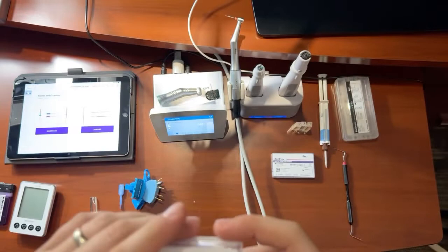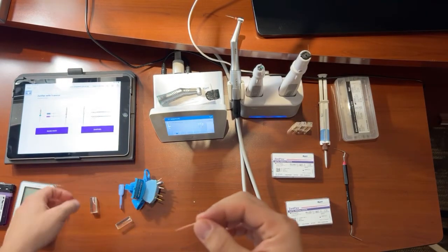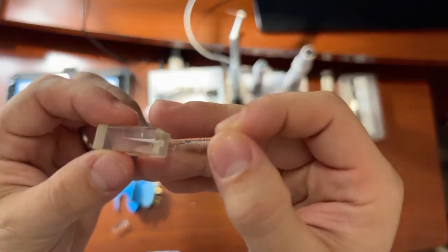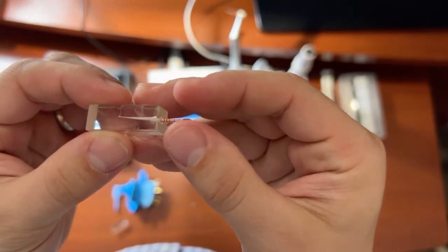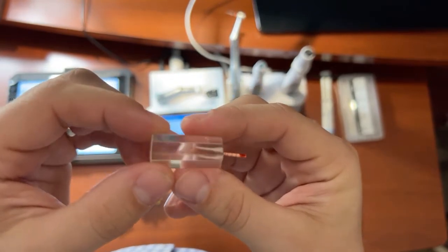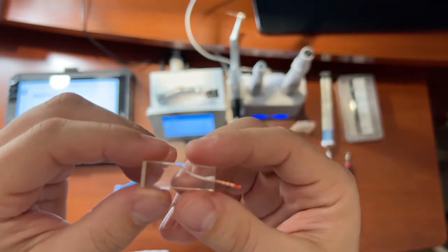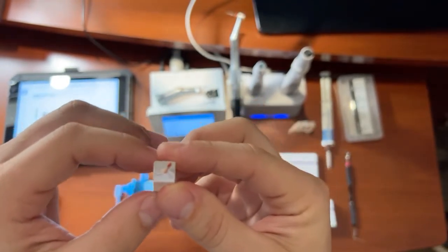So we shaped to a 2506, and it should match perfectly to the 2506. So I'll just put that in there for us. Here we go. So should match up perfectly. It's harder to see because there's debris in there that I was not able to irrigate out, but nonetheless, it's going to be a perfect fit.